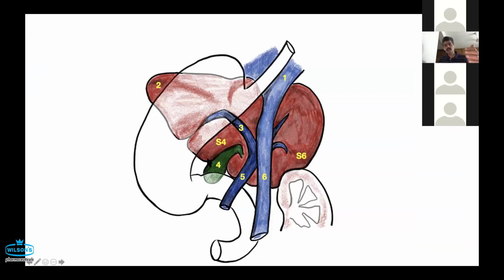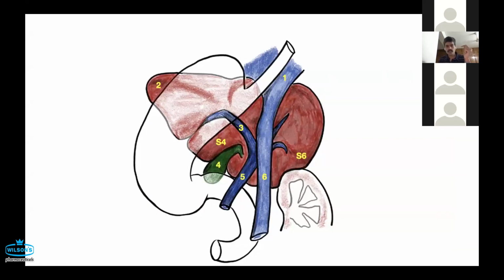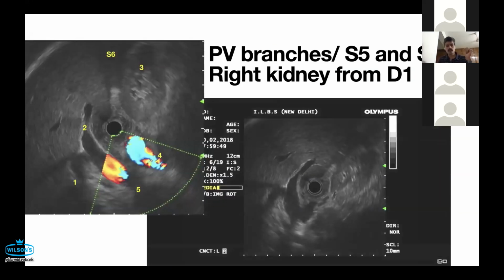And this is a cartoon that I have drawn of why you see the IVC and the portal vein on opposite sides of the duodenal bulb when both are behind the duodenal bulb. You see the converging duodenal folds here. This is the portal vein, this is the IVC, this is, sorry, the left portal vein, and the gallbladder. Note that the left portal vein and gallbladder are approximately perpendicular when you are doing radial EUS imaging. And let me show you how.